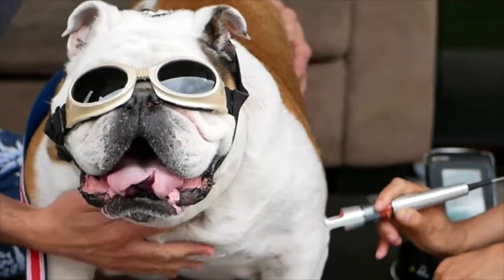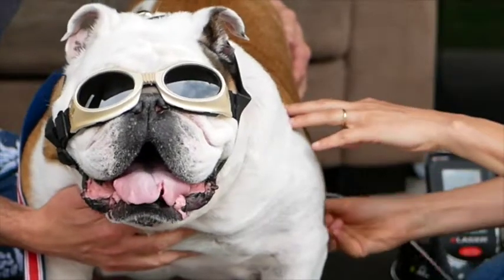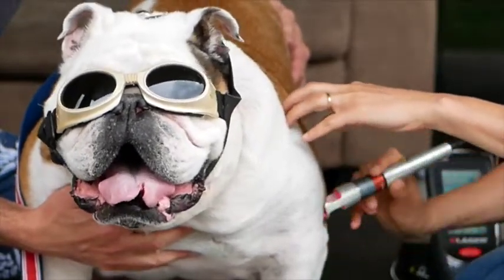arthritis cases, absolutely. We would typically do a course of 5 alternate days as before, and then we would evaluate, and then sometimes we will do a course of 5, let's say every 3 months. Other times we will do one a month. Sometimes we will do just one treatment every 2 or 3 months. It really does vary. And you normally find that owners are quite compliant here because they see the difference to how the dog or the cat is doing.